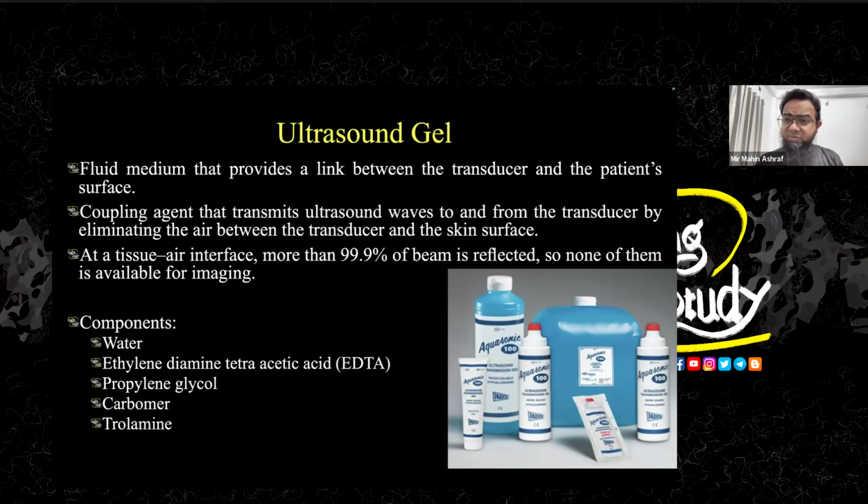So the air is very big notorious substance for us. When we are holding this transducer to my skin surface, you see there's some air in between these two surfaces. So air has a very bad notorious property of just distracting the sound. Like a microphone or speaker, the sound will go here and here, but not entering into my body. So we want all the sound to enter into our body and get reflected back and received by this piezoelectric crystal. So we don't want it to get to any other place.